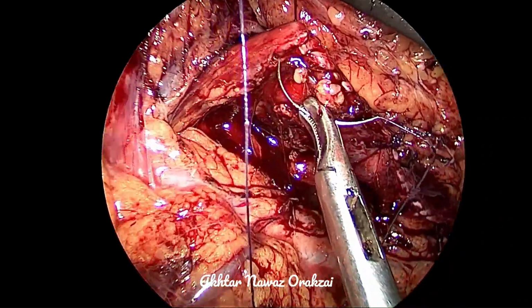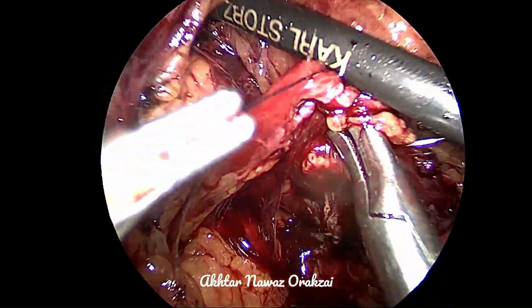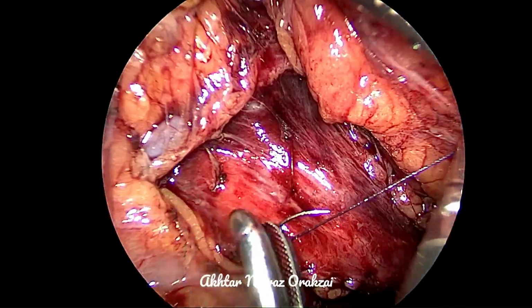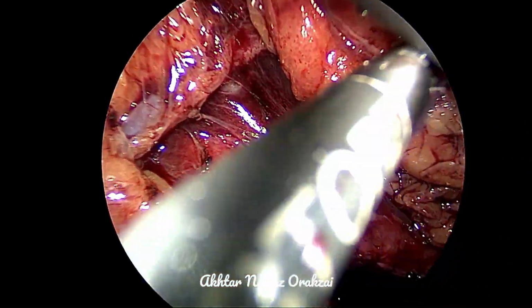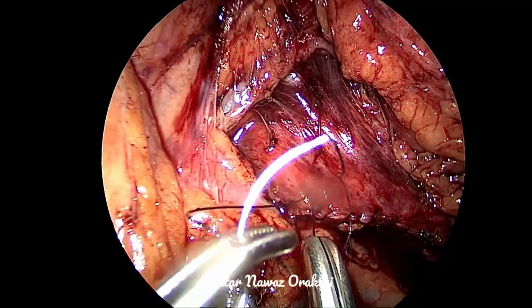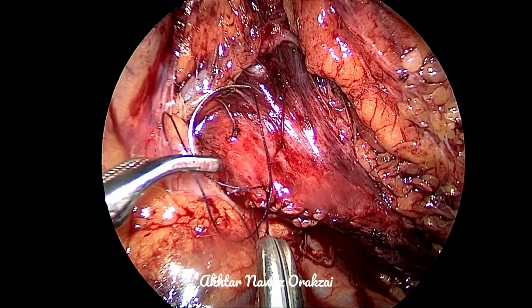So we are remaining with one last stitch. After that, we'll do a thorough washing of the cavity, peritoneal cavity, and remove any clots. Re-examine our anastomosis.